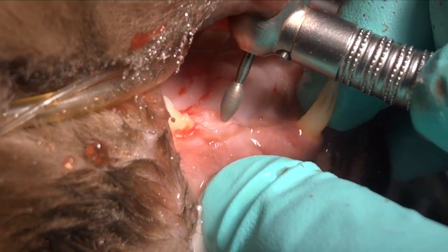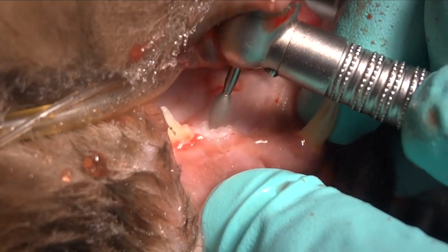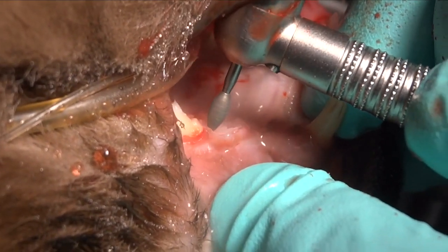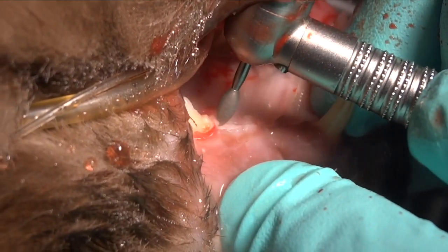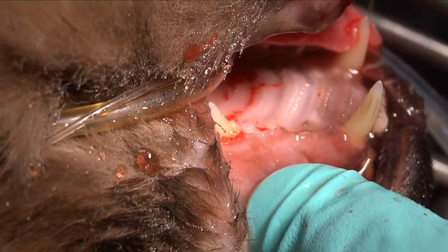Make sure that radiographically there are no projections coronally from that tooth or bone, and then once we're comfortable with that after we've confirmed it radiographically, we can come back and suture that with 5-0 monocryl using a P3 needle.